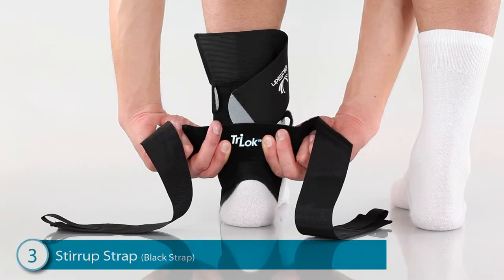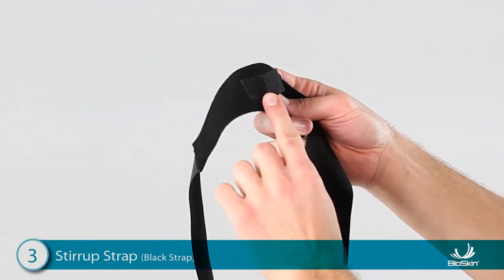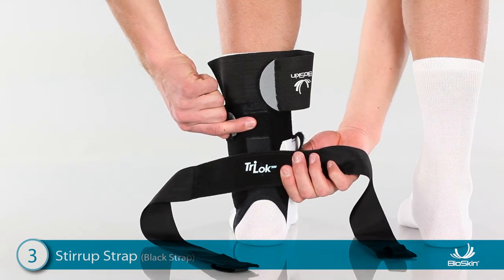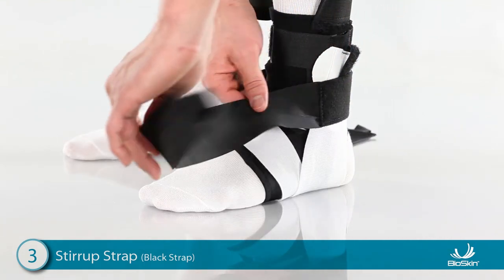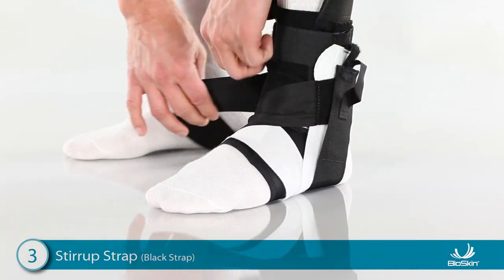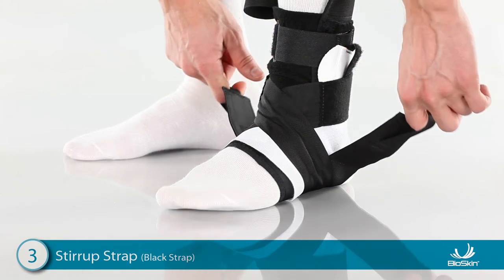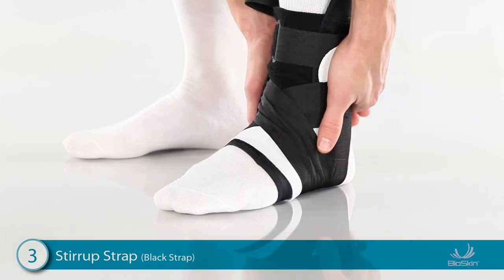Step 3: applying the black stirrup strap. Start by locating the Velcro tab in the center of the strap. Apply this tab to the back of the ankle so the straps lay to the sides. For very narrow feet, you may use the upper attachment. Next, position the foot at a 90-degree angle and wrap one side of the strap over the front of the ankle, then wrap it under the heel and attach high on the ankle. Wrap the other side over the front of the ankle, then wrap it under the heel and attach high on the ankle. For increased stability, use the finger loops to detach both tabs, lift the toes up, pull up firmly on the straps, and reattach.